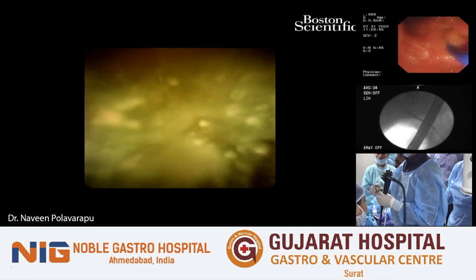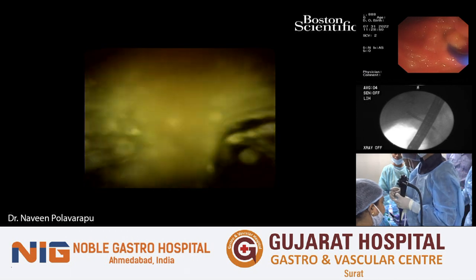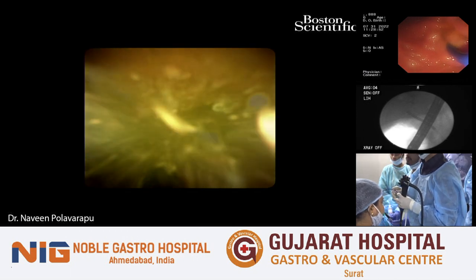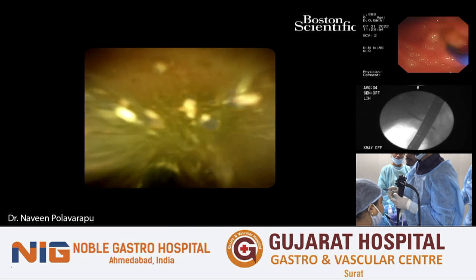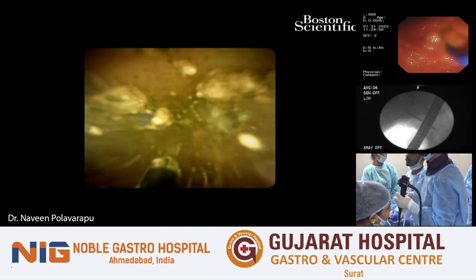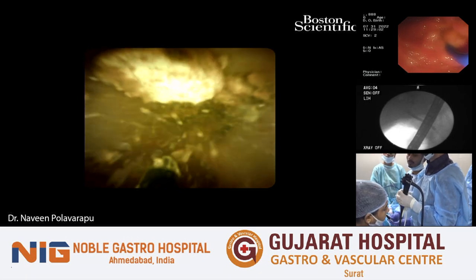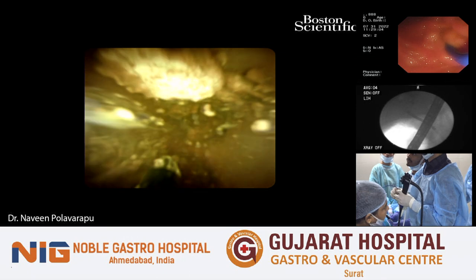Sir? Yeah, that is Dr. Vinit. You want to ask, sir, some question? Supposing the stone, while flushing the CBD, goes intrahepatic. Then what do we have to do in that situation? Yeah, if it goes intrahepatic, it gets jammed. So there's nothing to worry about. You can still get those stones using a Spy scope, EHL. You can still use it.